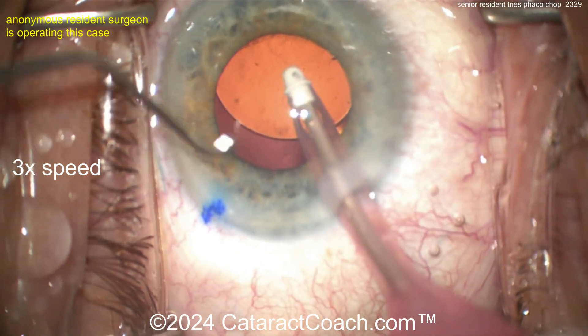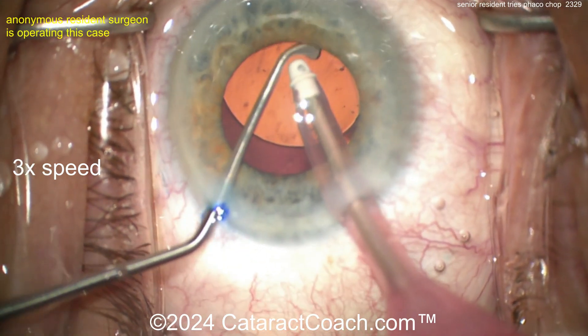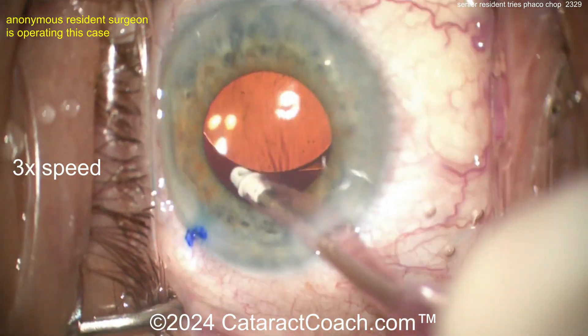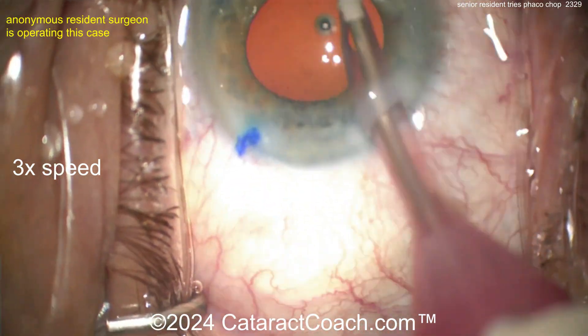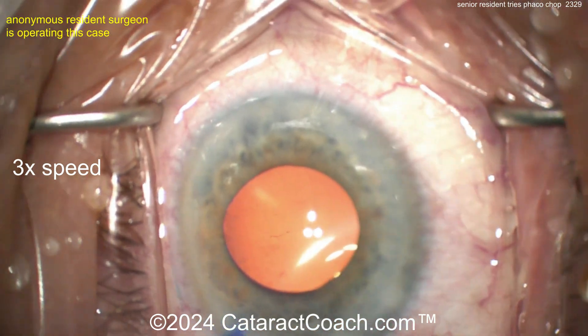Now removing the viscoelastic — let's see, going behind the optic. That's what I told you to do and you're doing it. You read the Jedi mind voice without even hearing it: go behind the optic, remove the viscoelastic. Beautiful job — what a beautiful case.